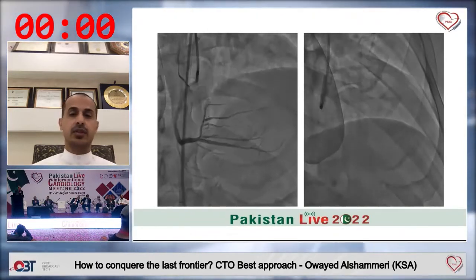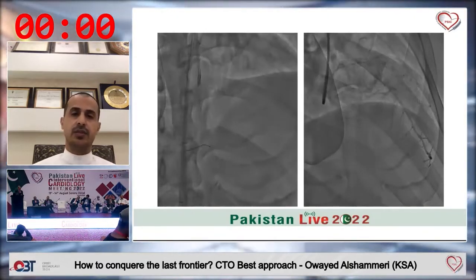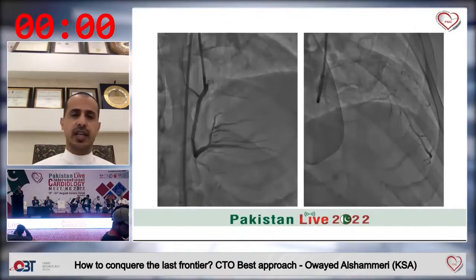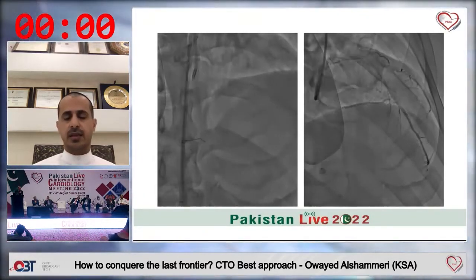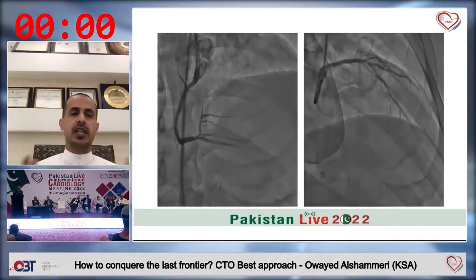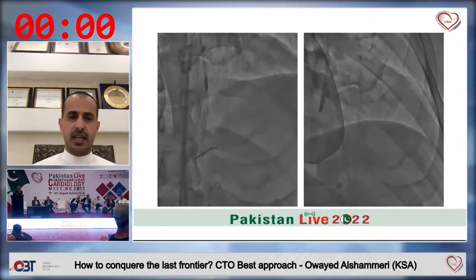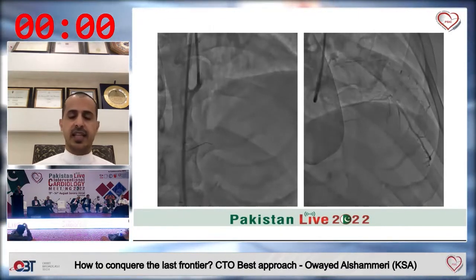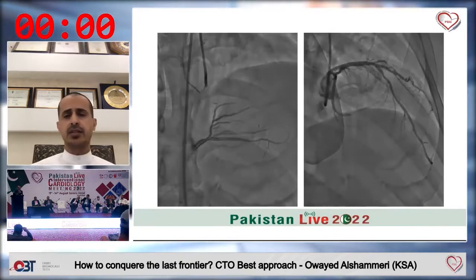So I don't think, to be honest with you, that in the case of Omar the left main is significant. I think he's right. It's just to proceed to the RCA, then pay attention to the left main in his case, especially as the patient had a cath in June, and it was definitely assessed at that time, just 2 months ago.